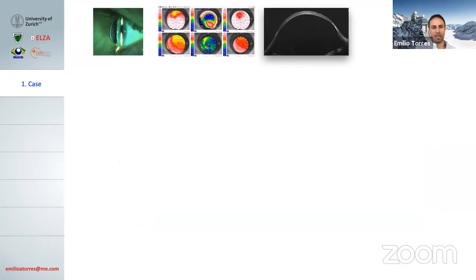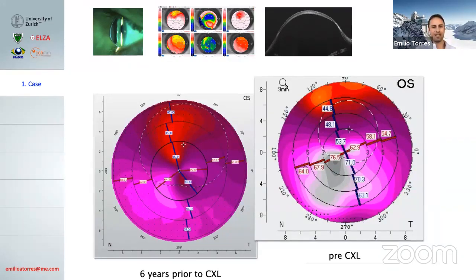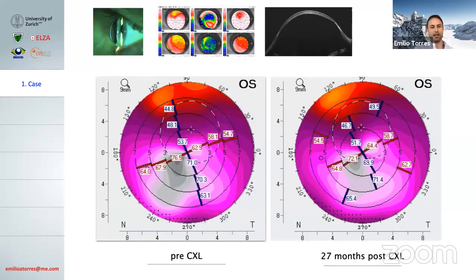And here is the preoperative progression. So before cross-linking, just to illustrate this case, and eye stability more than 2 years after individualized cross-linking. So this is not a subject, but just to show you how we used this technology in our favor to really see almost limbus to limbus, both sides, with high resolution in a keratoglobus patient.